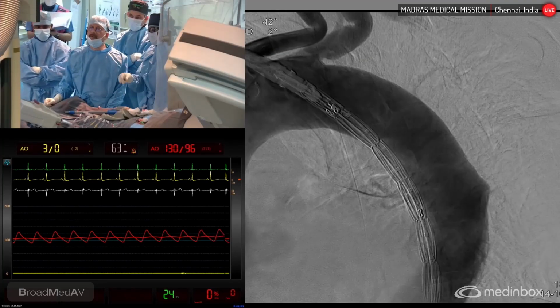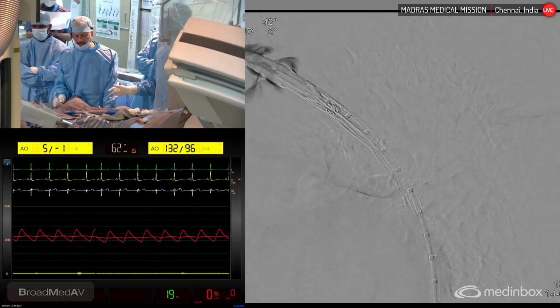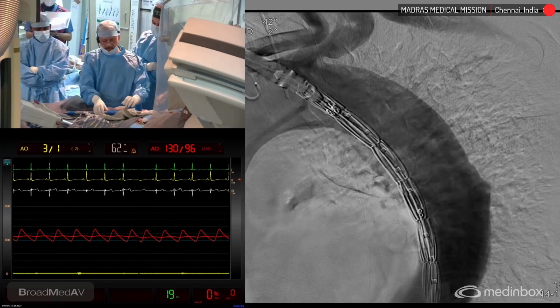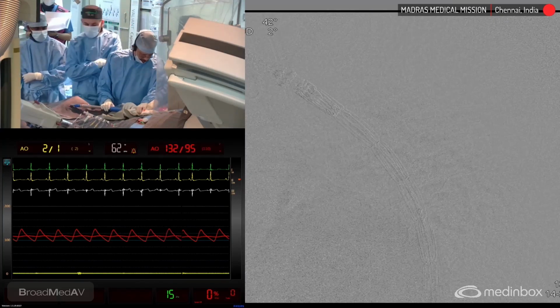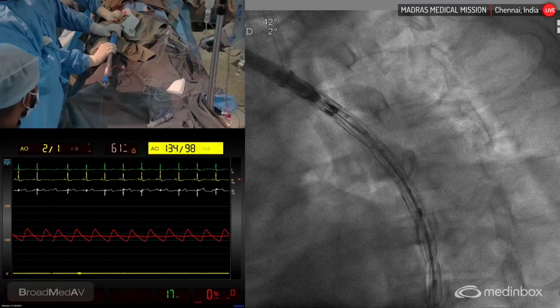Would you like to start deploying the distal portion, or is it okay? I think, anyway, based on the proximal length, it should be okay, right. It should be right. I think you take over the deployment. So we'll start how to deploy this Valiant Captivia device. You take the fluoro controller.